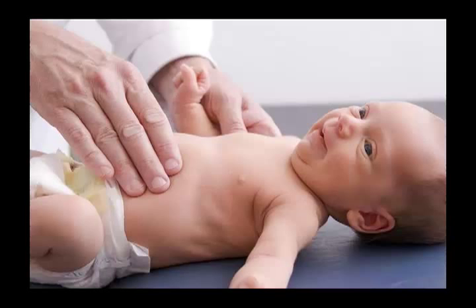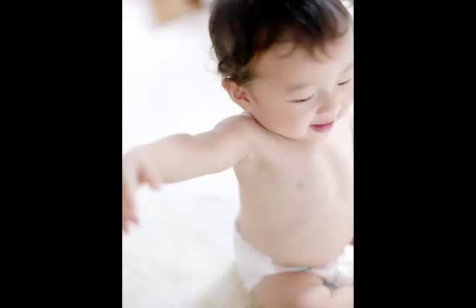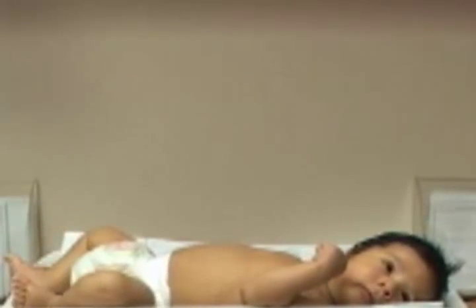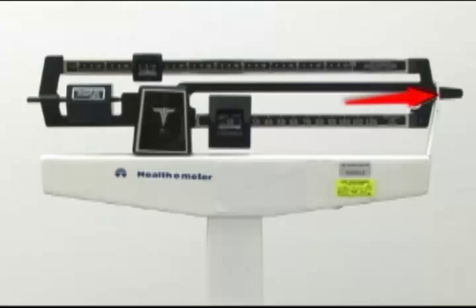Have the caregiver gently place the child onto the center of the scale. Younger infants should be measured lying down. You can consider weighing older infants sitting up so they fit comfortably in the center of the scale. Make sure the child doesn't hang on to the caregiver and that the caregiver isn't holding or touching the child — that way, you get a really accurate measurement. Also, try to make sure the child can't touch the sides of the scale and that all of his body is within the scale's tray, because this too will affect the weight.